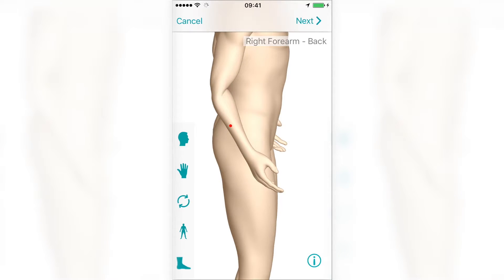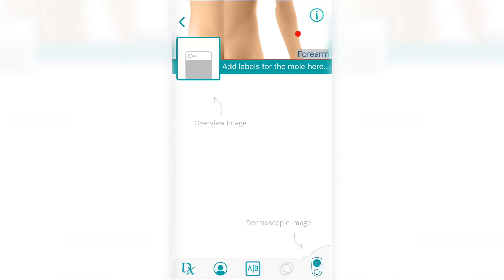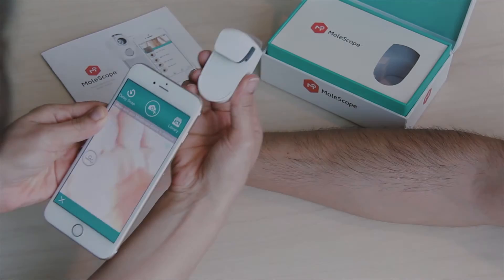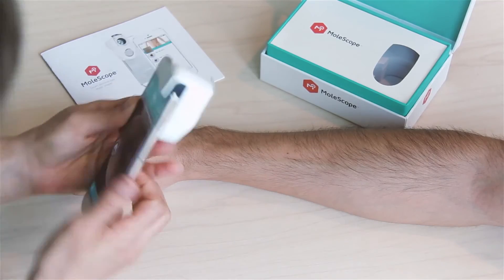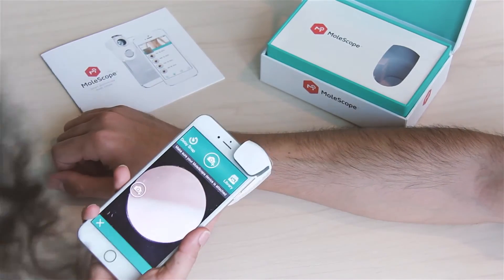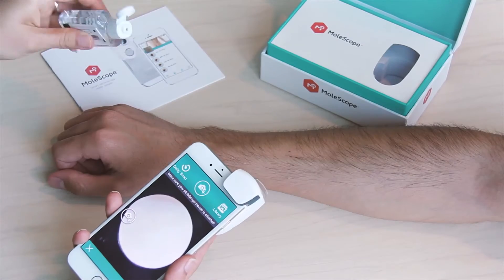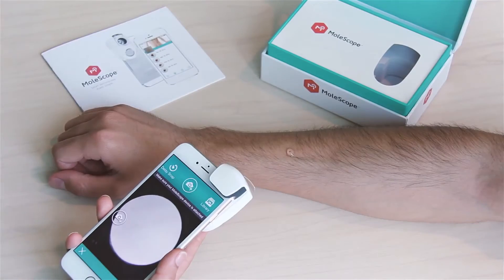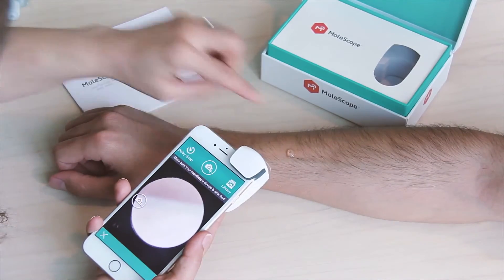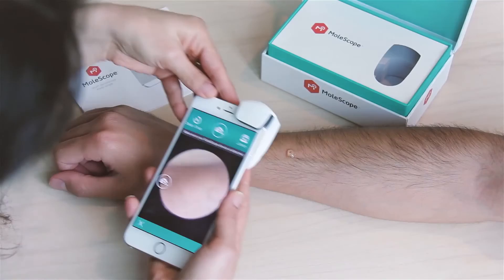Mapped lesions are highlighted and dermoscopy images can be added to each lesion profile. You can add and upload clinical overview images and dermoscopic images taken with the Molescope device or any other smartphone-attachable dermoscopy device. To take a dermoscopic image using Molescope, simply slide the device over your smartphone camera and attach tightly. Apply gel onto the skin and turn on the light prior to capturing the image. Gently press the Molescope flat against the skin and the gel.